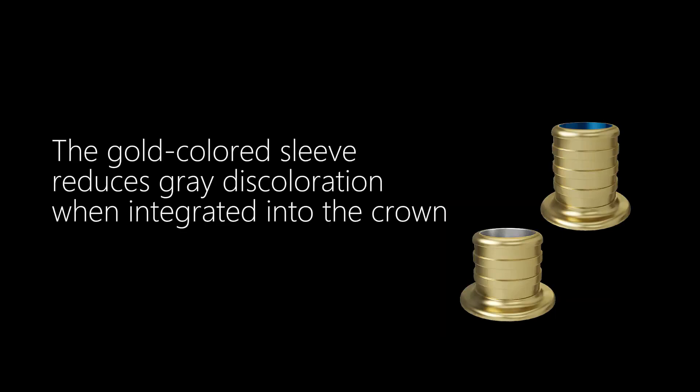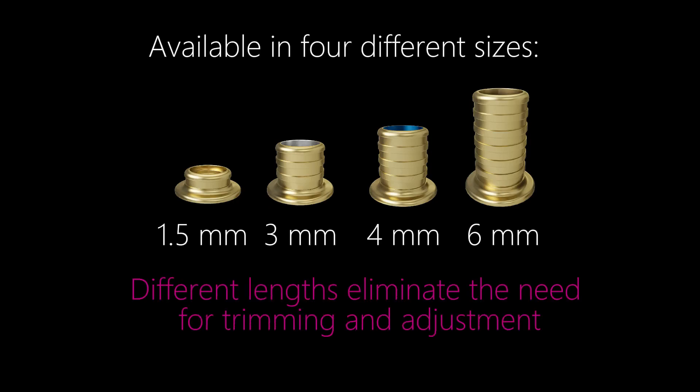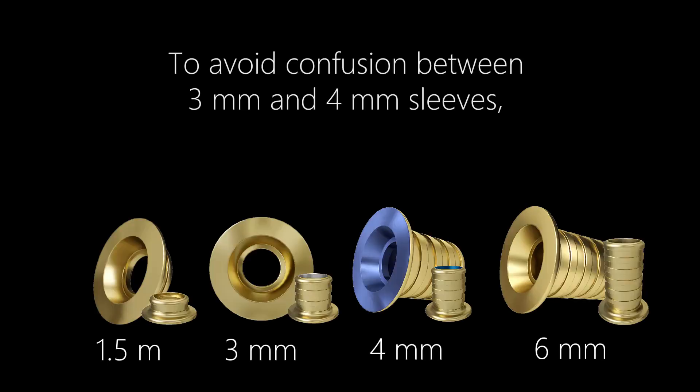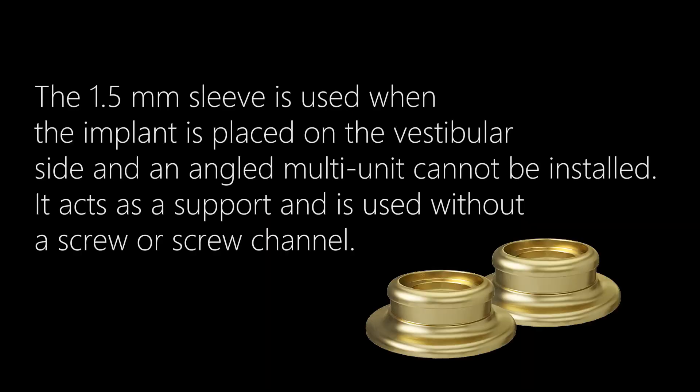The gold-colored sleeve reduces gray discoloration when integrated into the crown and is available in four different sizes. Different lengths eliminate the need for trimming and adjustment. These sleeves are designed for use with Pro multi-units. To avoid confusion between 3 mm and 4 mm sleeves, the end of the 4 mm sleeve is painted blue. The 1.5 mm sleeve is used when the implant is placed on the vestibular side and an angled multi-unit cannot be installed — it acts as a support and is used without a screw or screw channel.